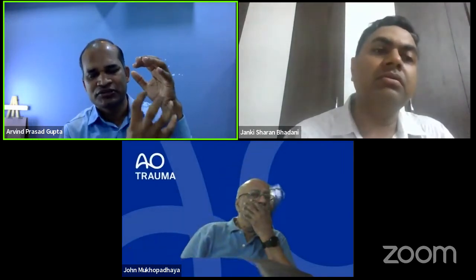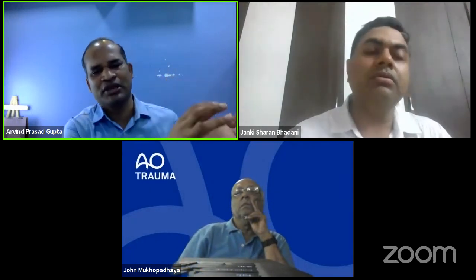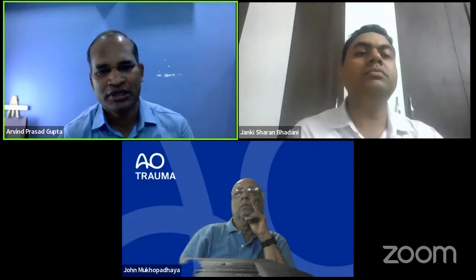In your lecture, you told about dislocation. The chance of dislocation is more in reverse shoulder. So what can we do to reduce that? The chance is almost 2 to 3.4%. Reverse shoulder is an inherently stable joint, because it gets medialized and inferior. So the chance of dislocation is less in comparison to hemi or total. It's stable in comparison to the others, but even then dislocation happens.